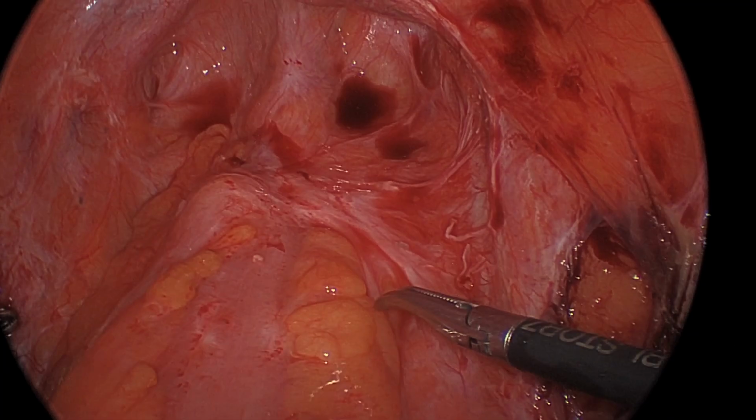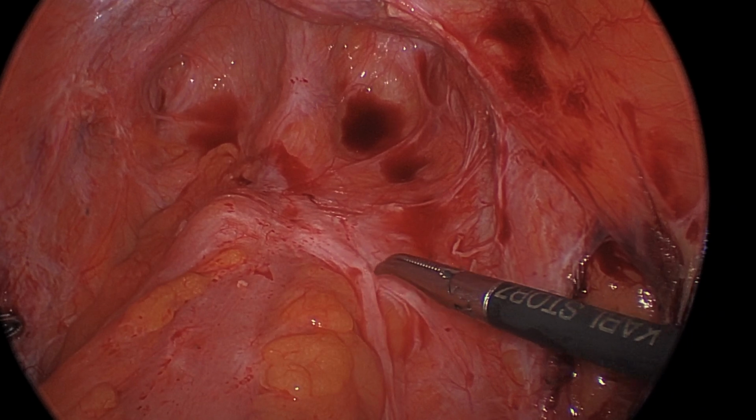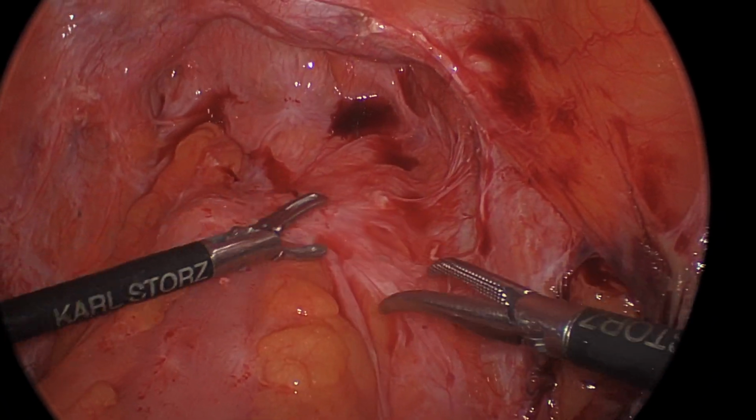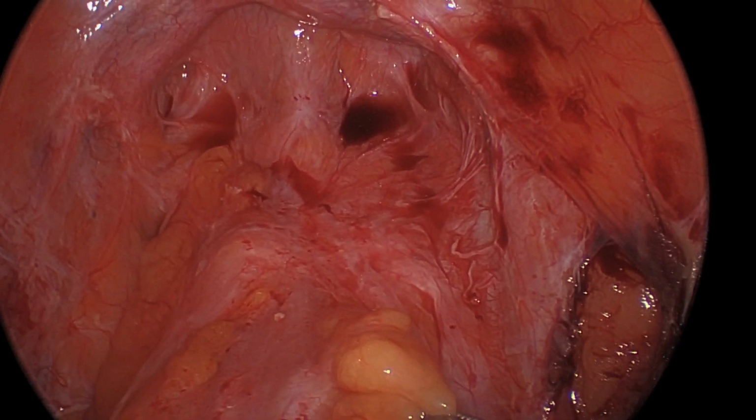On initial inspection of the pelvis, the lesion was difficult to identify. This was because of the patient's previous surgical history, where an area of deep endometriosis of the rectosigmoid colon was shaved and subsequently oversewn. This caused a nodule to lie deeper within the muscularis and thus was harder to identify with inspection and tactile feedback alone.